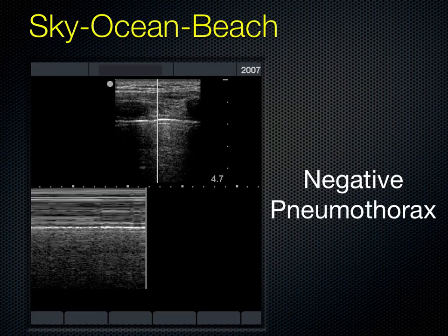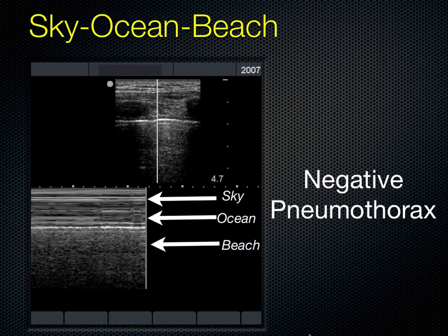So here's several examples. The M mode line running through the pleural line, M mode over several seconds. You have the stripe because this basically is a reflection of everything that's happening along this line in the muscle layer, so you have some striped striations to that. The bright white pleural line, which is right here, and then as the lung moves back and forth with breathing, you get this back and forth graininess. So it appears it's like waves coming onto a beach, Sky-Ocean Beach.